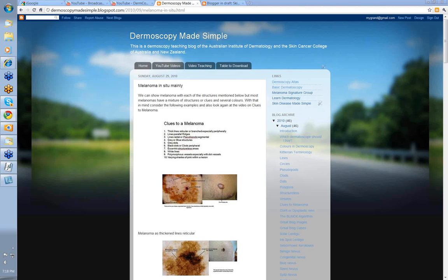Hello, my name is Ian McCall and this is another video from the Dermoscopy Made Simple series. Today we're going to talk about melanoma in situ mainly. Very often you'll get reasons that the vast majority of it's melanoma in situ with a small invasive component. What I want to go over is to look at all the features that can be associated with melanoma.